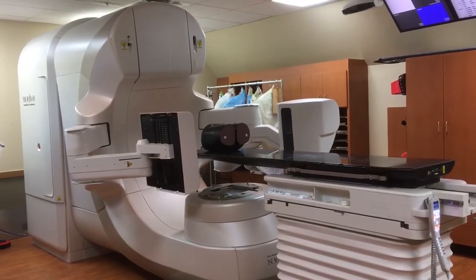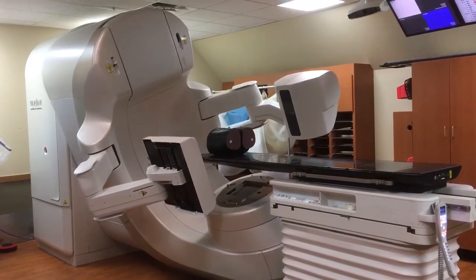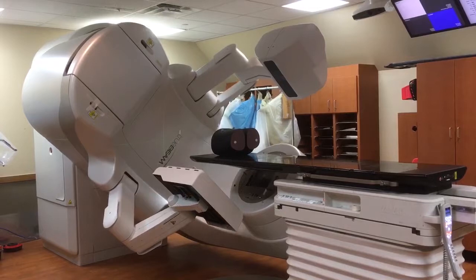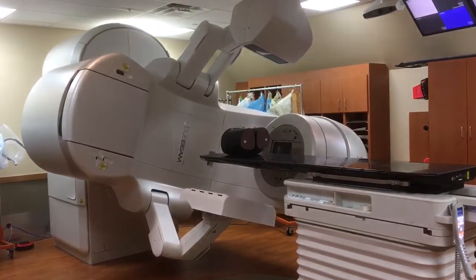Now we'll take a cone beam CT. This uses the KV imaging panels and requires a full rotation of the gantry to get a 3D picture of the patient's anatomy.